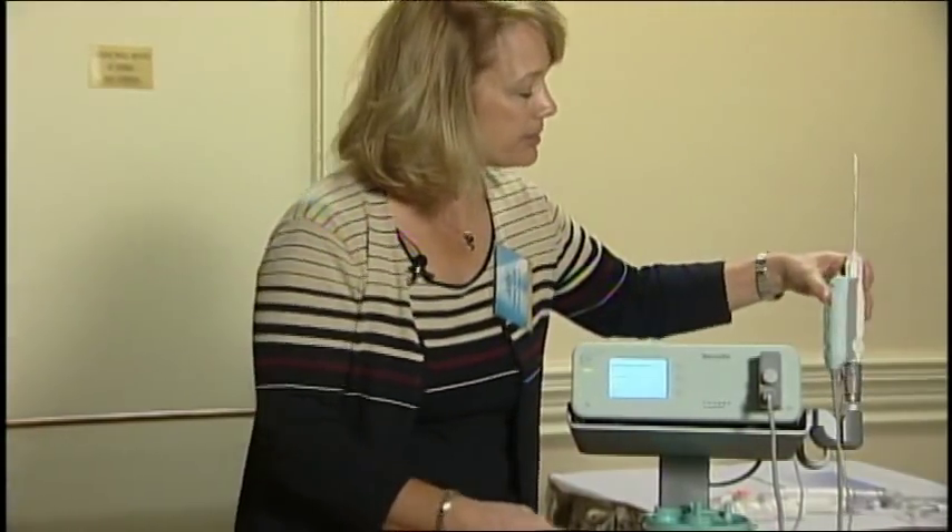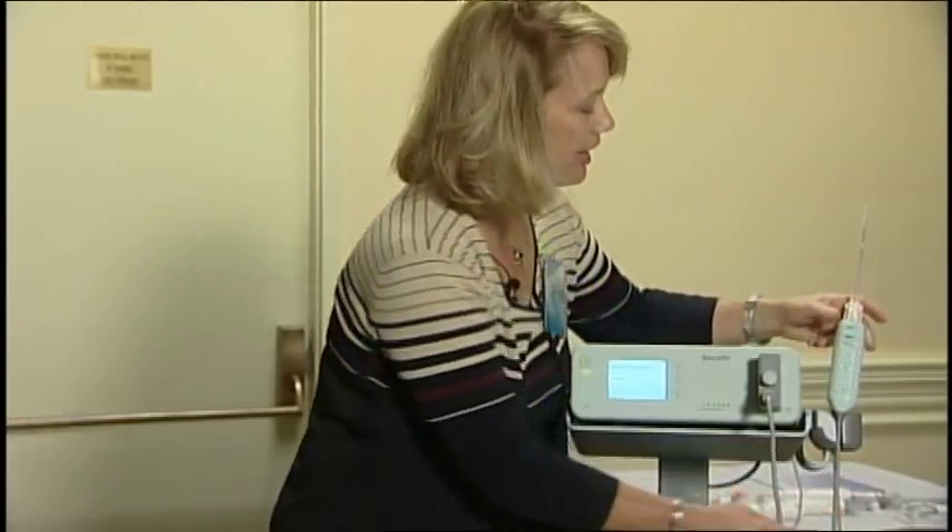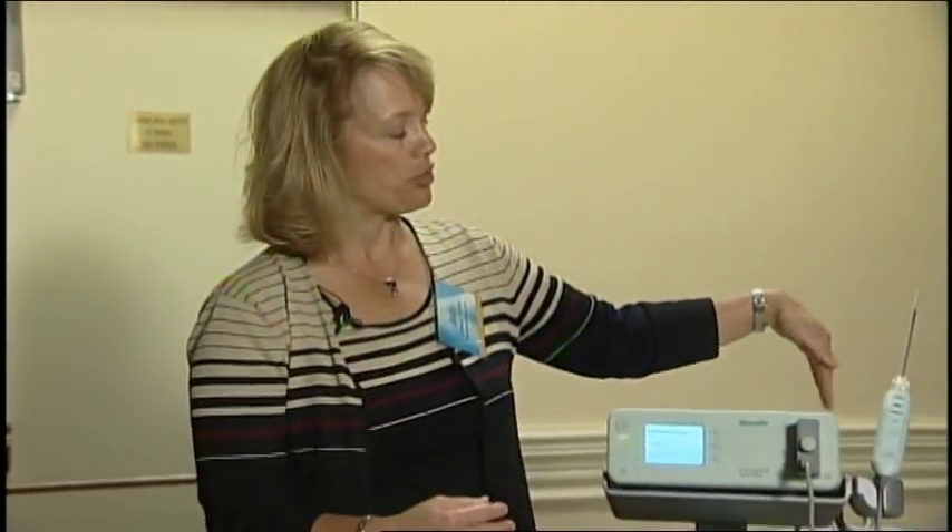I do drape this with a sterile towel so that the patient isn't looking at the equipment through the procedure.